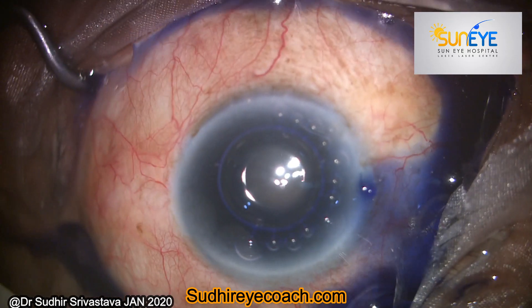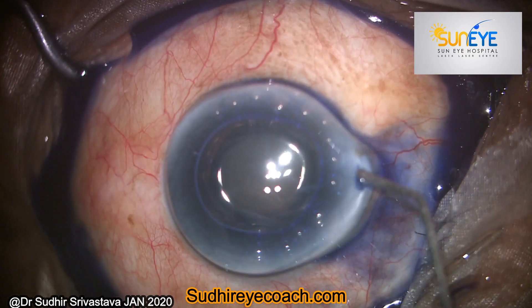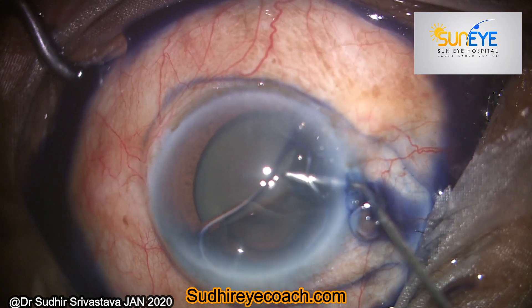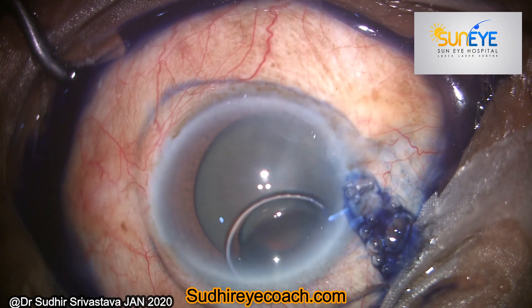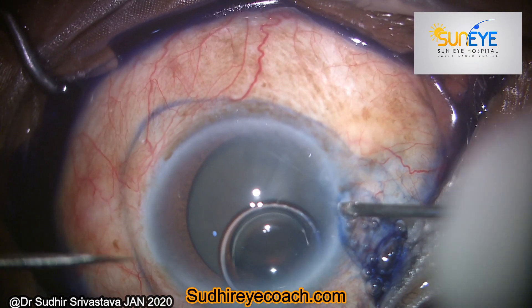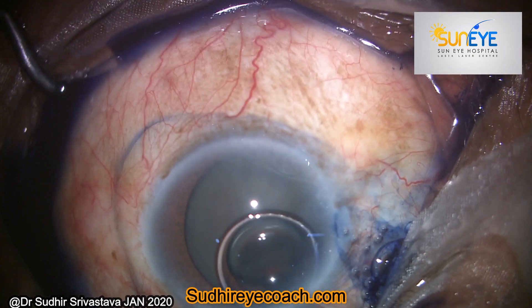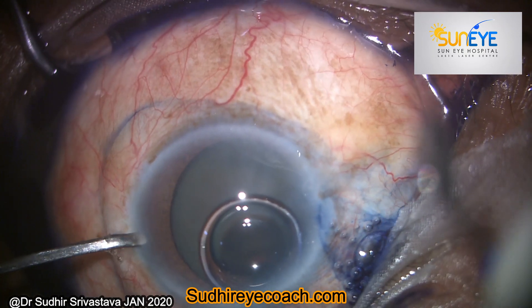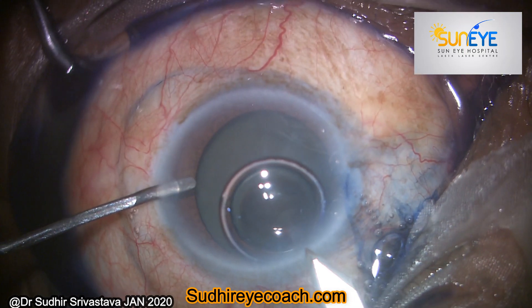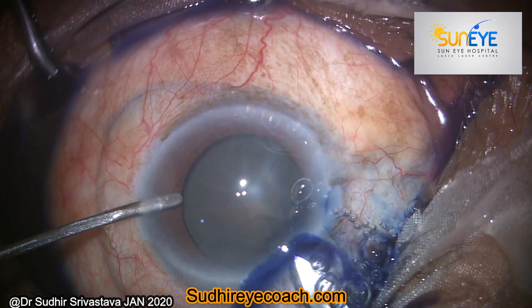But for this surgery my assistant has given me a 19 gauge MVR blade. I filled the viscoelastic from my first side port incision, and during the process of my second side port incision I entered the cornea fully with this 19 gauge MVR blade. Then I prepared my clear corneal 2.2 mm incision. The nucleus was grade 4 plus.